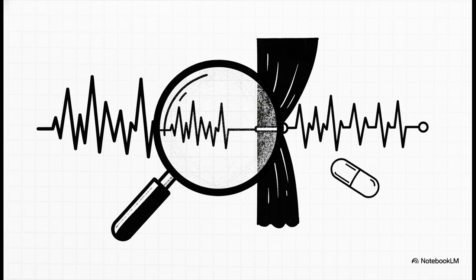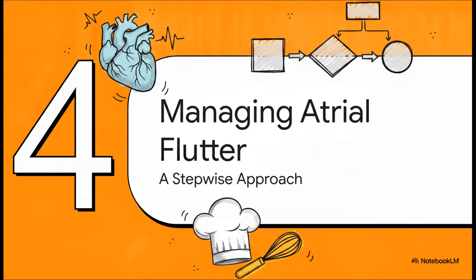Suddenly, you reveal those hidden, continuous sawtooth waves just marching right along the baseline. Which brings us to Section 4, Managing Atrial Flutter.